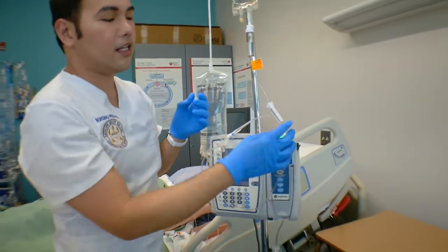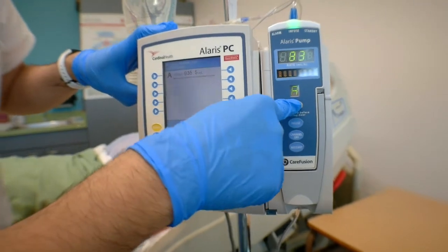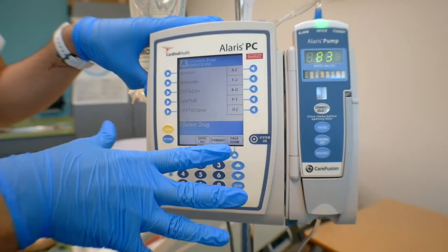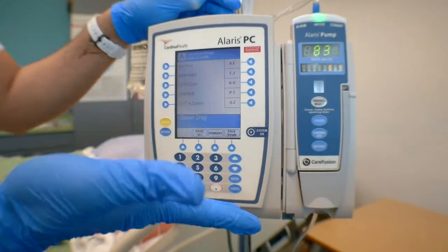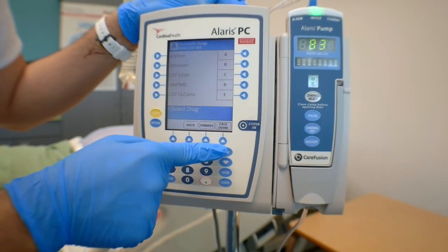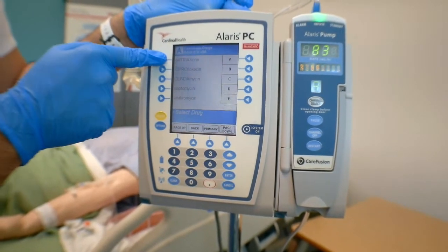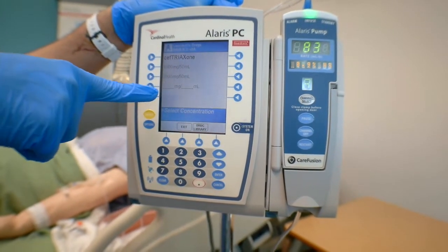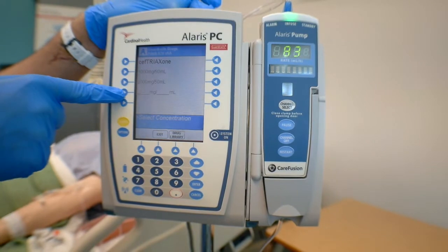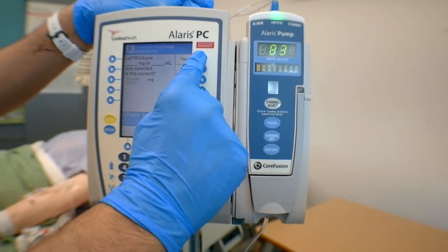Alright, so now we're ready to infuse our secondary. So for you to infuse that, you're gonna go back to your channel, so channel select, and then you're gonna find secondary. And it's going to give you an option of the antibiotics or medications that you would want to infuse. So since we want ceftriaxone, we're gonna hit A to E. Yeah, you're gonna press page down and just find ceftriaxone. Make sure that it's the right medication that you're giving the patient. And this one does not have the default of what concentration we have. So we have to manually put it. So if you want to put it manually, just pick that and then say yes since we're putting it manually.